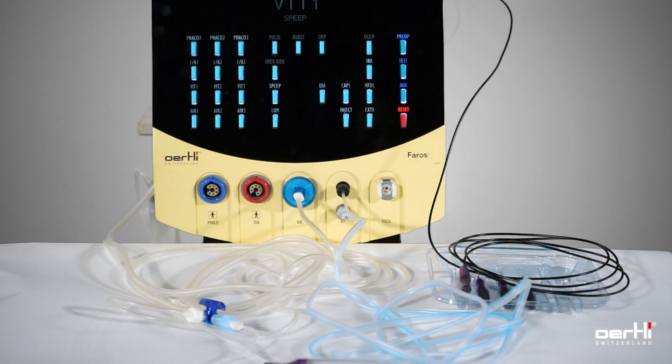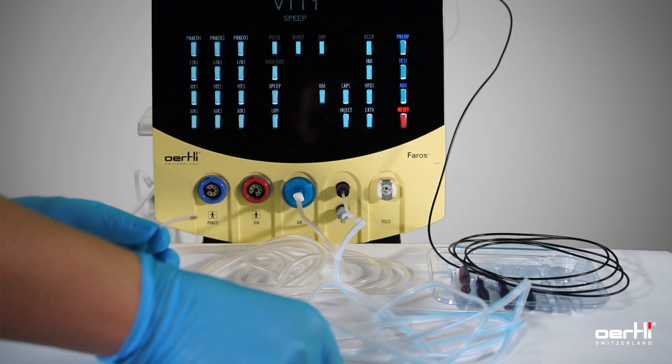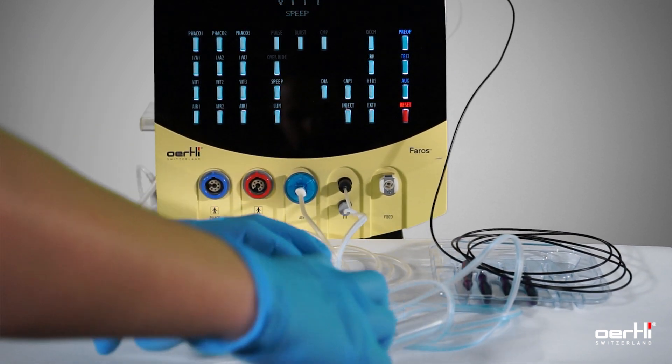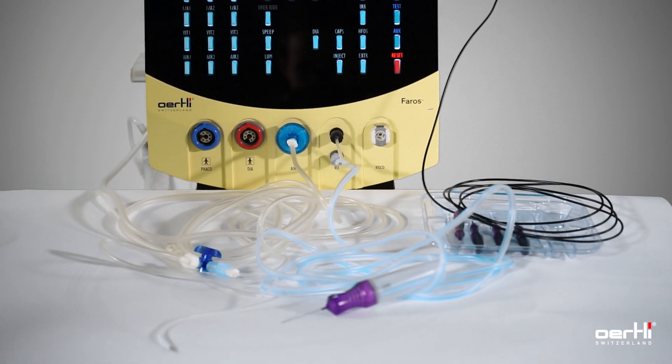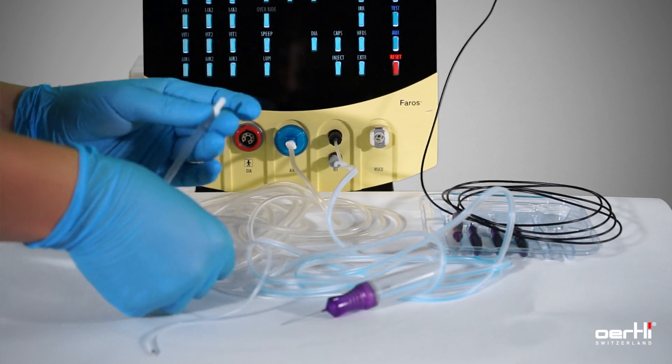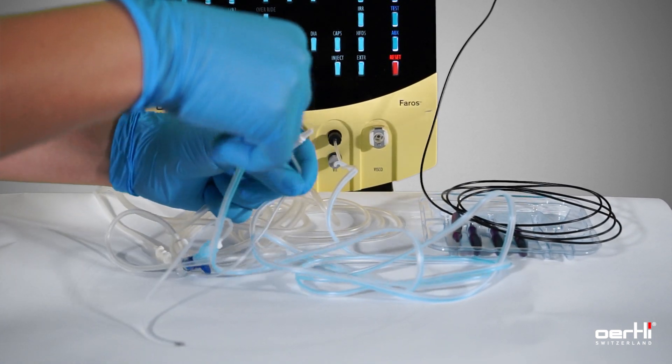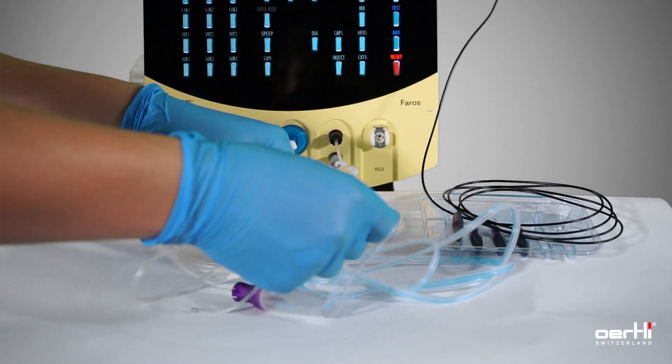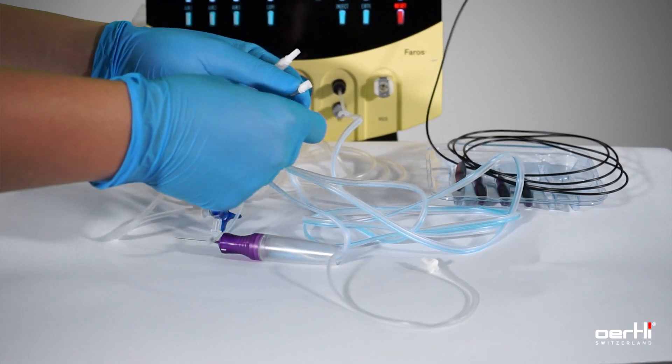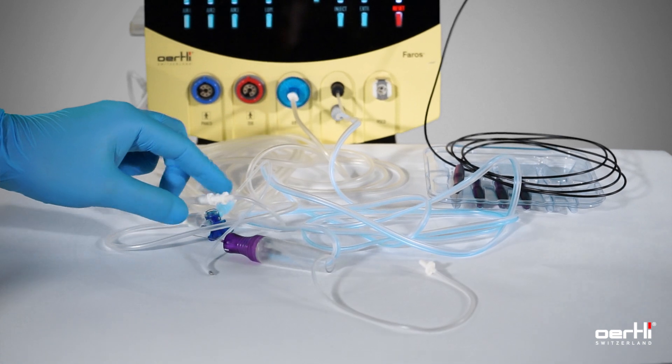For the pre-op, you have two options. Either you use the infusion line and the cutter directly inside of a small bin or whatsoever you have available on the table, or you connect the irrigation line and the aspiration line directly and perform the pre-op in that condition.